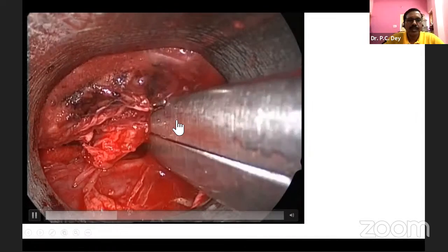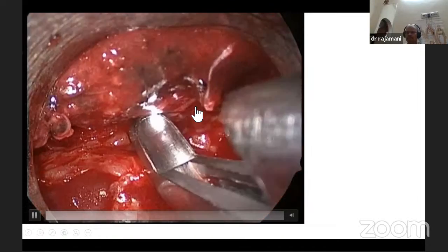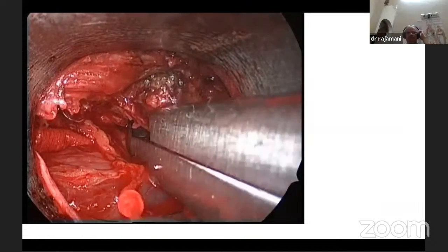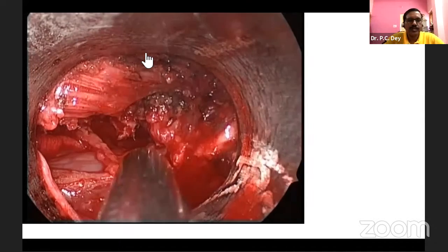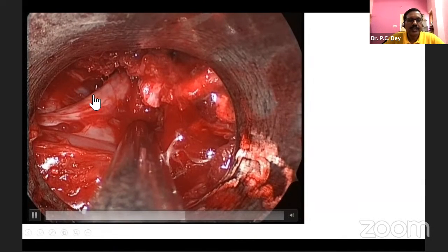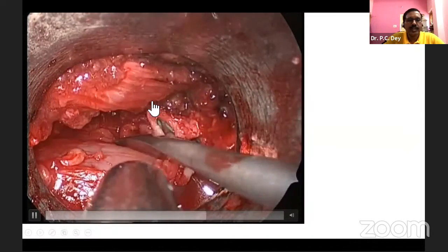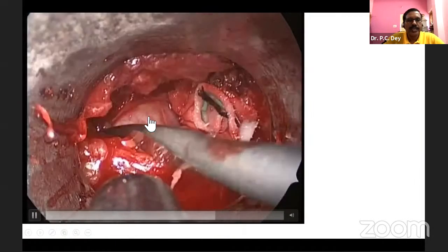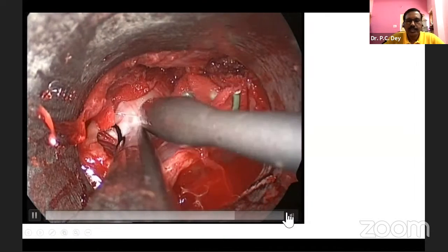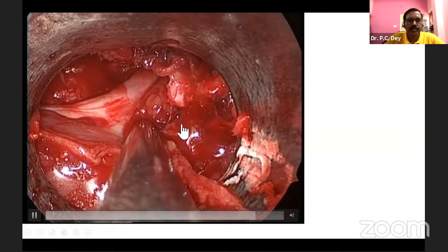And this is the ligamentum flavum of the midline, just below the spinous process. And we are going to the opposite side by undercutting the ligamentum flavum, and then the decompression of the opposite nerve root. This is the opposite side nerve root, and this is the dura. It's completely decompressed. Sometimes you can even have the discectomy of the opposite side. This is the beauty of the mobility of the instrument. You can tilt and mobilize to the opposite side, put a patty, and the disc also can be removed from the opposite side. This is the opposite side disc. So this is the opposite side nerve root, and this is the same side or left side nerve root.